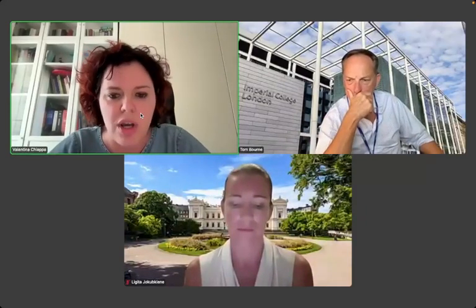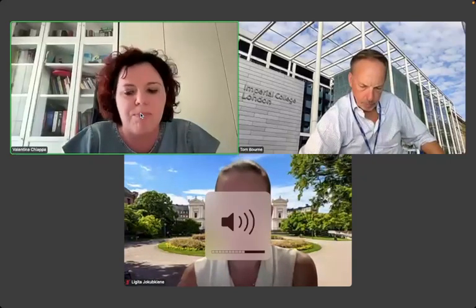Yeah, thank you for the question. It was a topic I would like to include in the presentation, but the time was too short. We perform fine needle aspiration or true cut both directly during our ultrasound examination. We prefer using true cut biopsy through transvaginal or transabdominal evaluation. For lymph nodes, it depends on the dimension of the node. If it's a very small node, we prefer using fine needle aspiration. For the nodes you have seen, we could perform also true cut biopsy.